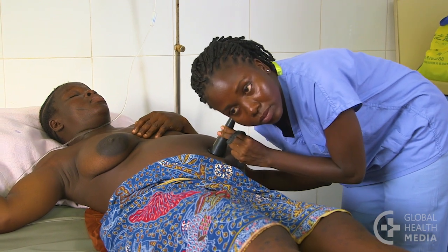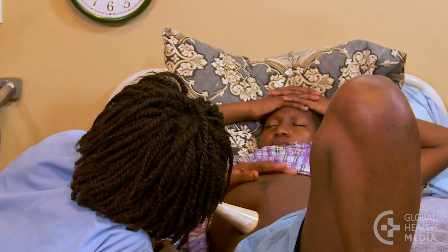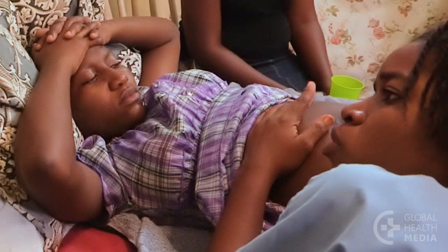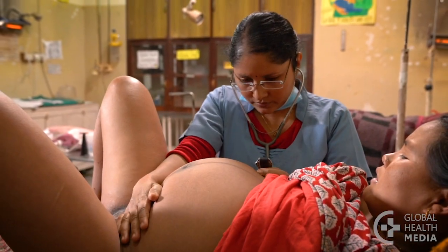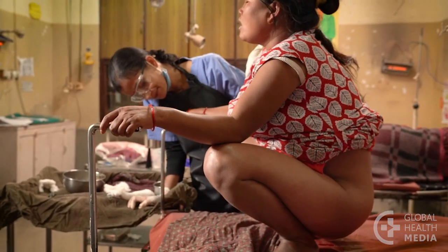Listening to the baby's heartbeat helps you know how the baby is coping with the stress of labor. Recognizing early that the heart rate is too high or too low is critical to saving baby's lives. This video will show how to assess the heart rate, how to decide whether it's normal, and what to do if it's not normal.